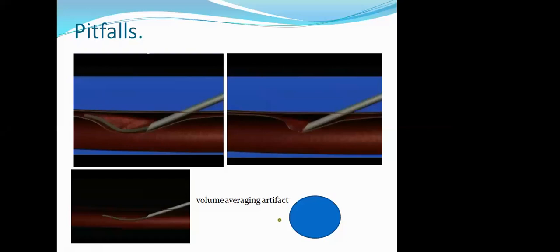So this is called the volume averaging artifact. Always remember that whenever your needle punctures the vein, you will see a small indent in the vein, and also you will feel a pop. The pop and the indent in the vein are very important signs in order to avoid the volume averaging artifact.